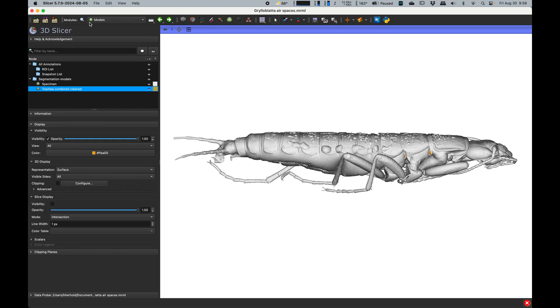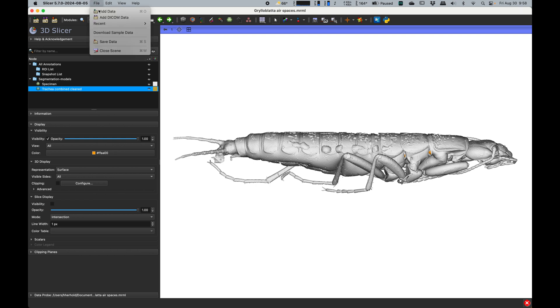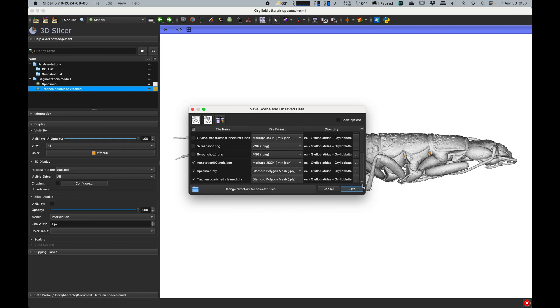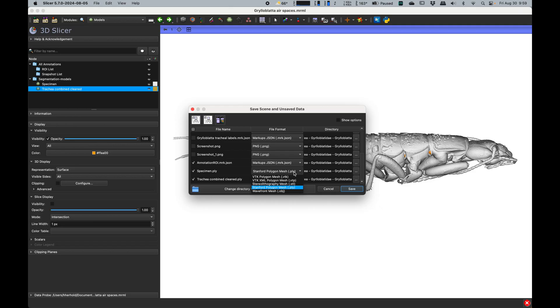So we say file save data, and if we scroll down here, these are the models that have been created. Now I save them as PLY files. You can also save them as a number of other different formats like OBJ, STL if you want to do a 3D print, even VTK if you want to do other things with them.